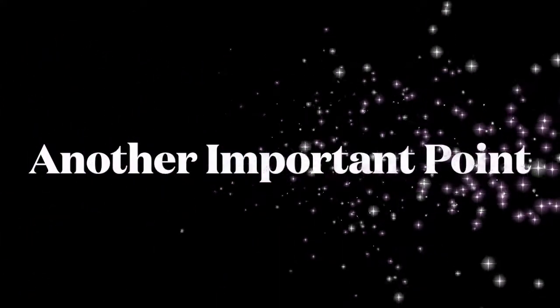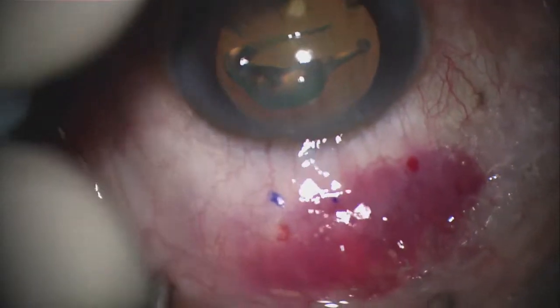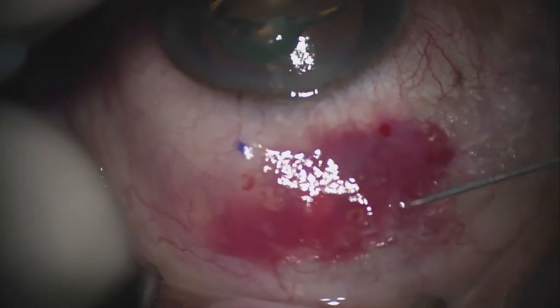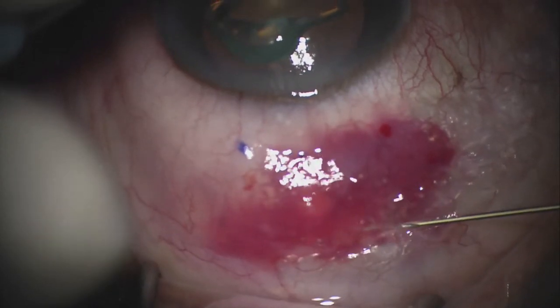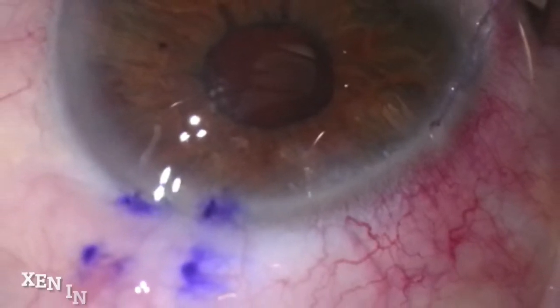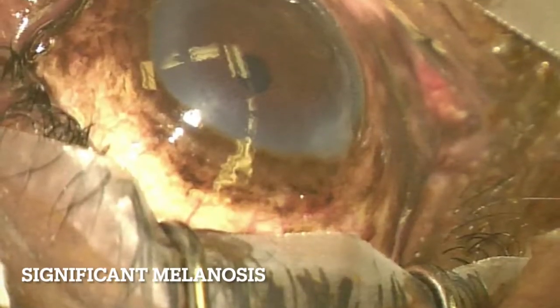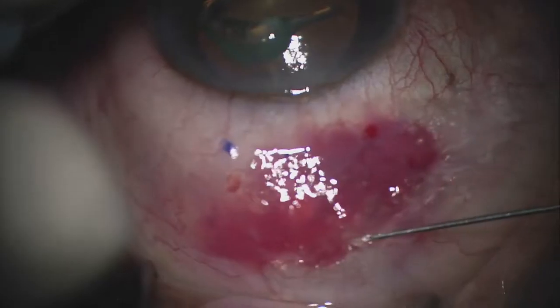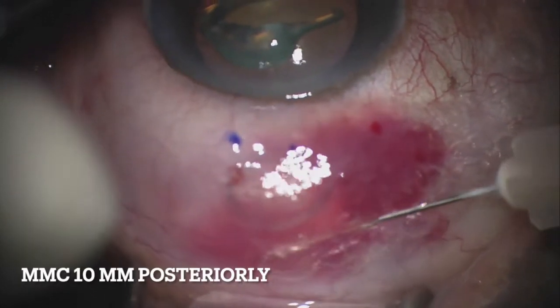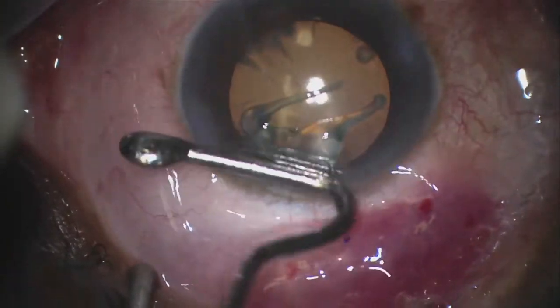One more important point has to do with the use of Mitomycin C. Realize that you can titrate the amount of Mitomycin C to increase or decrease your dosage and/or concentration depending on the patient and the risk of scarring. For example, you may use more Mitomycin C in a case where there has been a previous surgery or in a pigmented patient who has a high risk of scar formation. Also, remember to inject the Mitomycin C about 10 millimeters away from the limbus, then use an instrument to spread it posteriorly to create a pocket for the bleb.